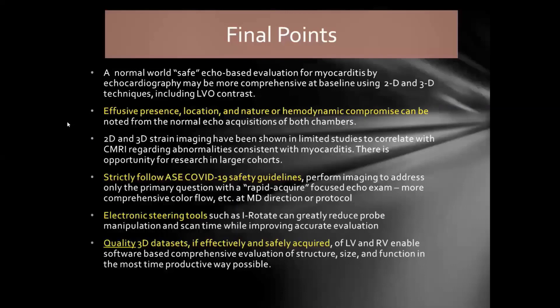2D, 3D strain imaging definitely have been shown in limited studies, various papers, to correlate with CMRI regarding abnormalities consistent with myocarditis.